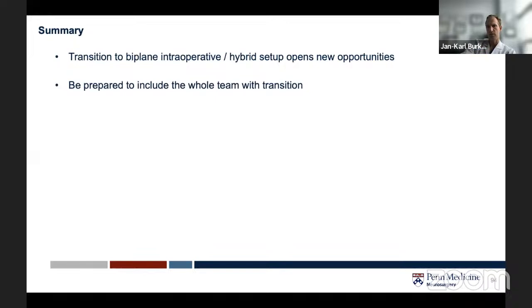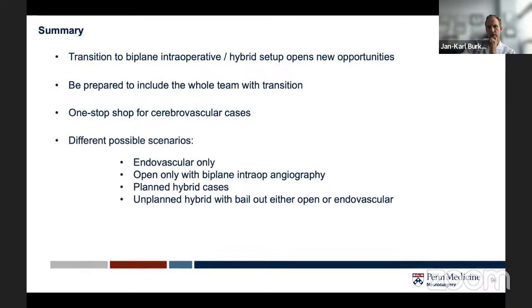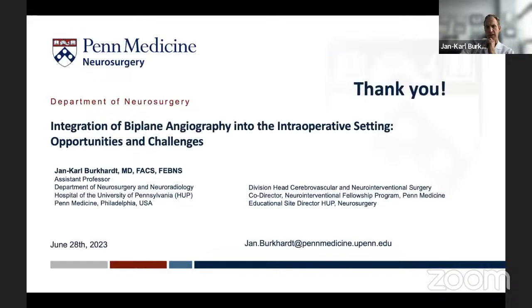And I really think it's a one-stop shop for a neurovascular case that's really useful. And there, as I highlighted in my presentation, there are different scenarios. With the setup, you could do endovascular only, open only and use the biplane as an intraop angio, or planned hybrid cases or unplanned hybrid cases. So thank you again for having me.